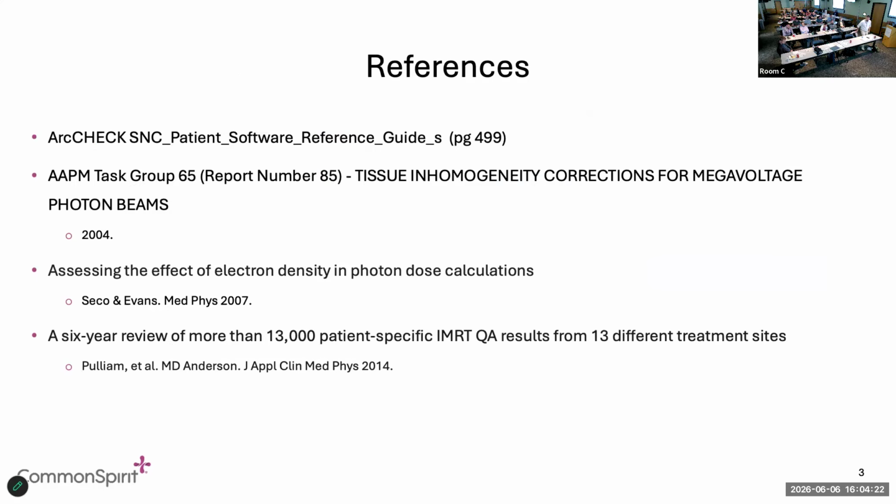And a funny thing that comes to mind is, let's say you have an IMRT QA that fails. What do you do? Some physicists will reshoot it and it passes. So now what do you do? Well, I've seen a lot of times where we just pass. So, funny science there.